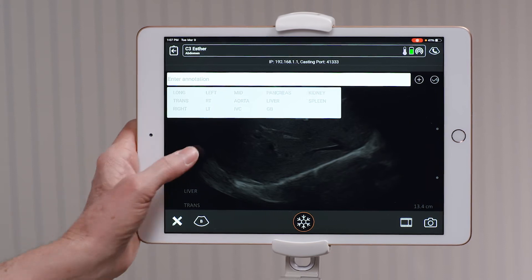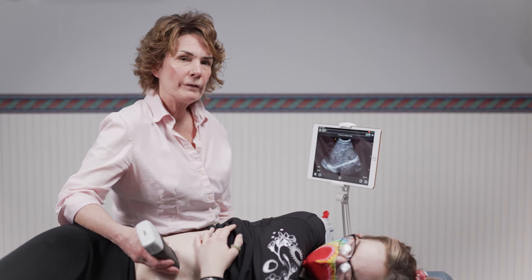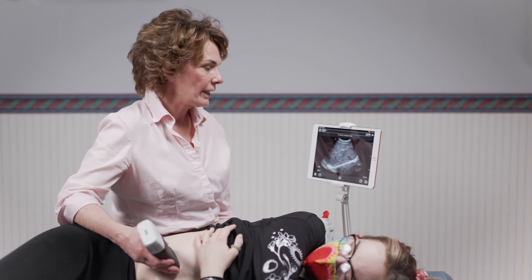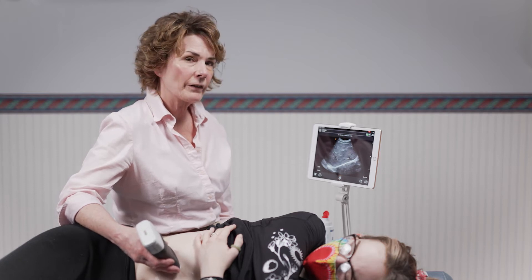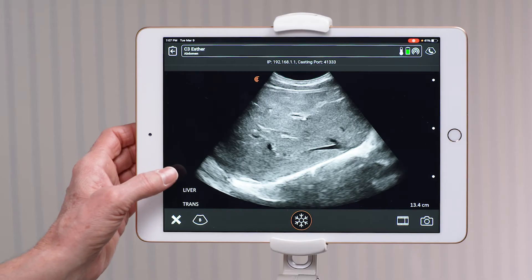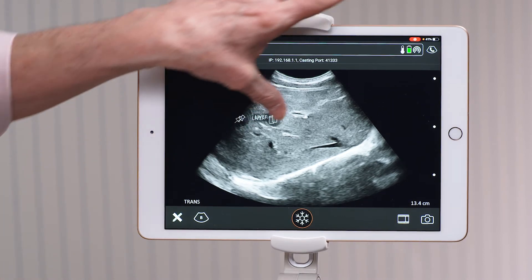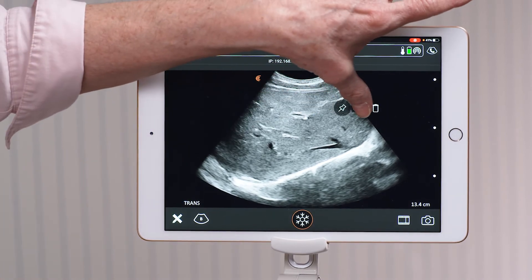you can see both of those — transverse and liver will be in the lower left hand corner. You can also move the annotations anywhere on the screen by tapping them with your finger and moving them to where you would like them to be.